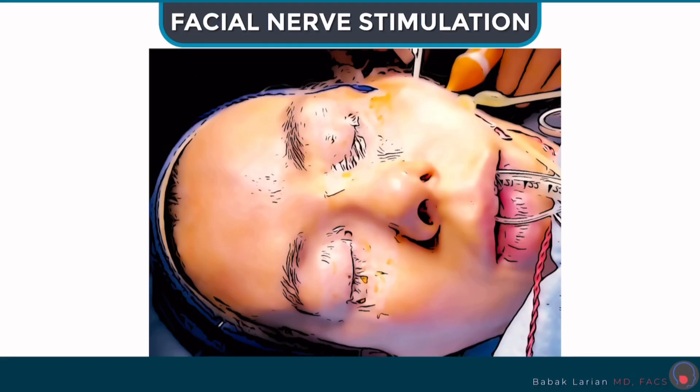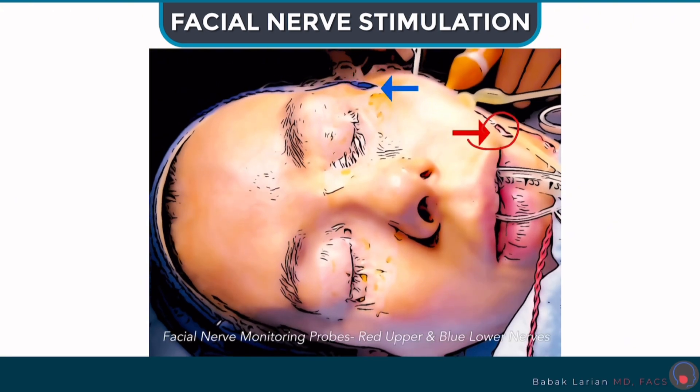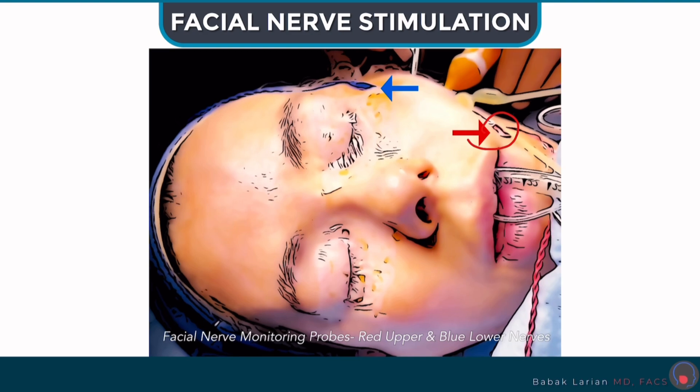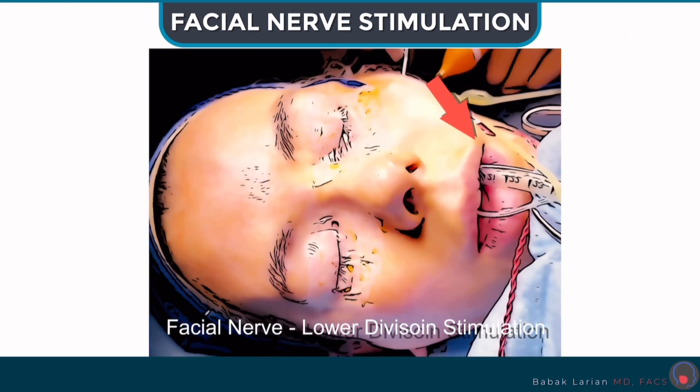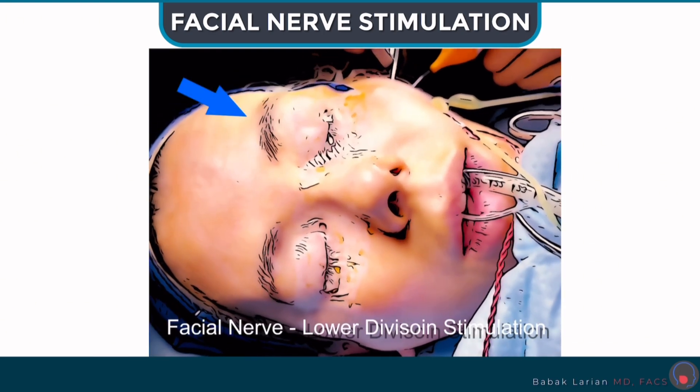During the surgery I use these probes that you can see here — these probes are for monitoring of the facial nerve. They assess the functioning of the facial nerve every time I get close, and it alerts me. Then I stimulate the nerve after the tumor is removed to make sure all the branches are working, as you can see.